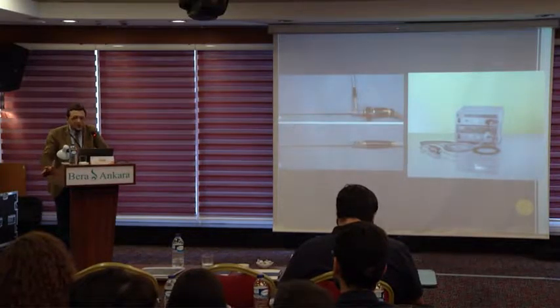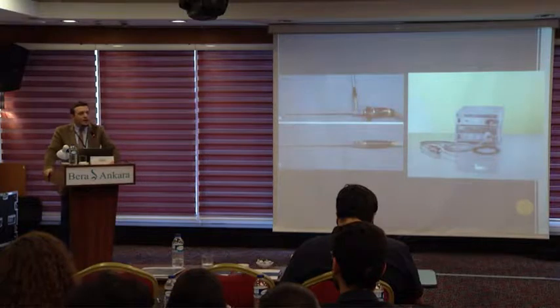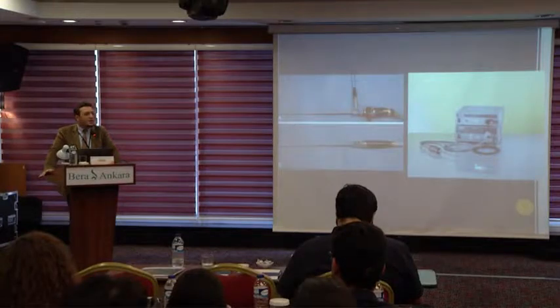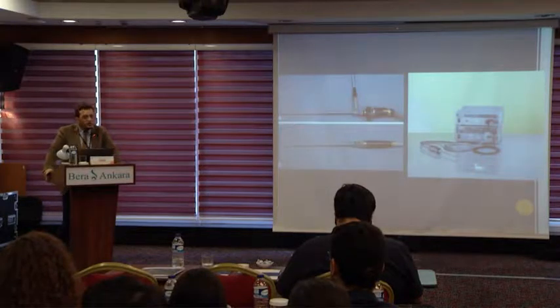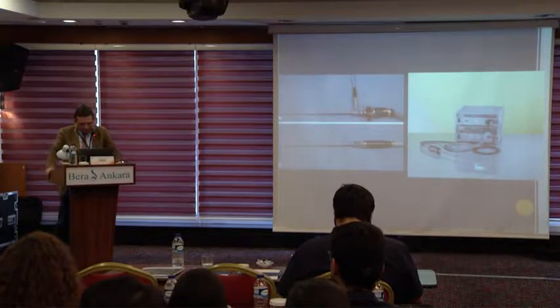Light source is important, maybe more important for urologists than for our colleagues like gynecologists or general surgeons, because they usually work intraperitoneally and at a short distance. But urologists sometimes work in the deep pelvis and in the retroperitoneal area. So it's advised to use at least 300 watts, and preferably a xenon light source.